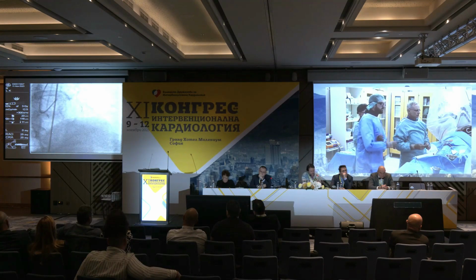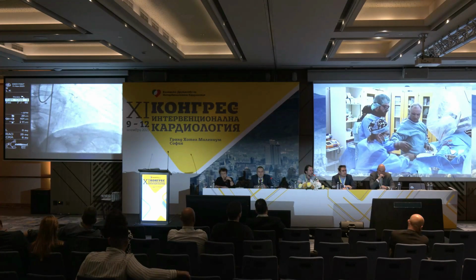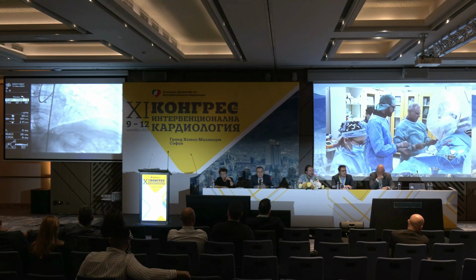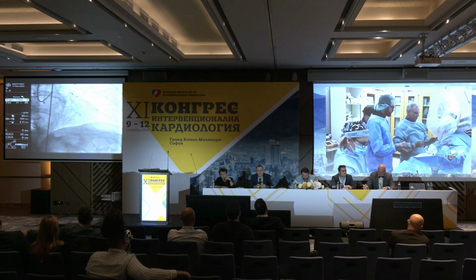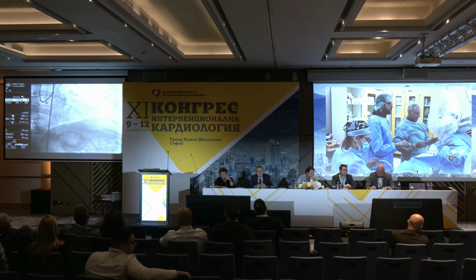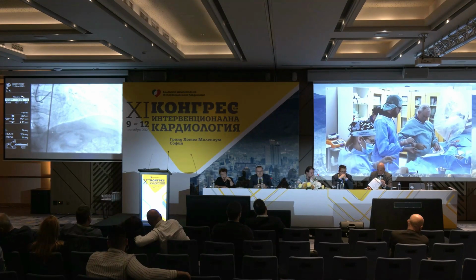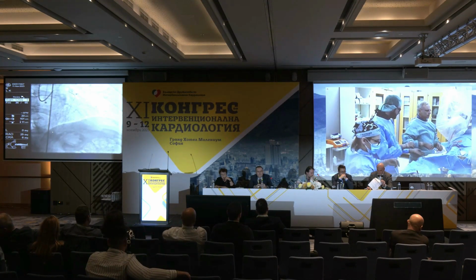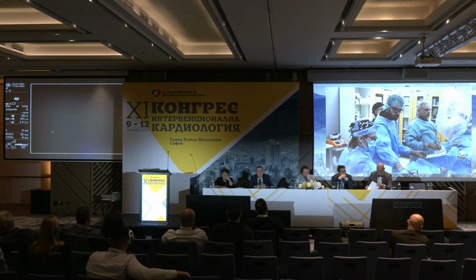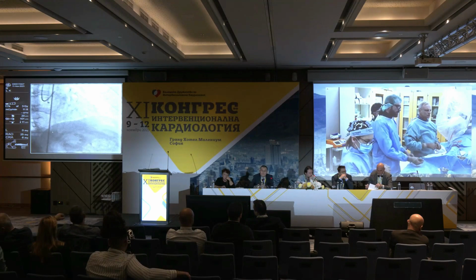I don't know if you have comments or what would be your approach here. When you are in retro, wouldn't you prepare the antegrade vessel first? A little bit more time. Yeah, we tried as much as we could, and you saw that we used stiff wires. We can do parallel wiring there, but in my view, I had quite difficult problems getting a better clarification of where I have to puncture. It's completely a blunt cap. The collateral, in this one especially, is not very clear.